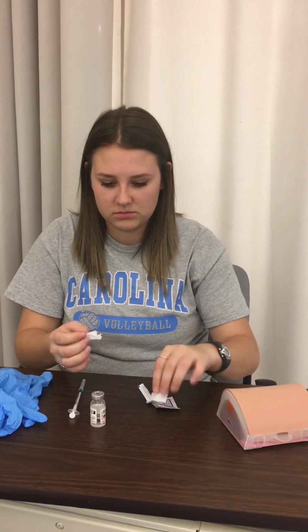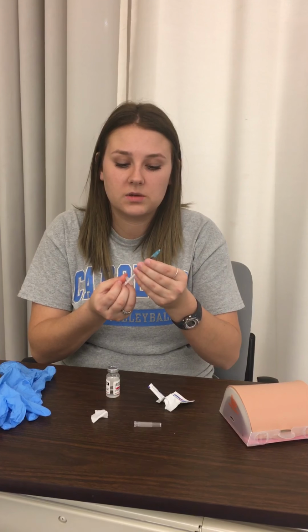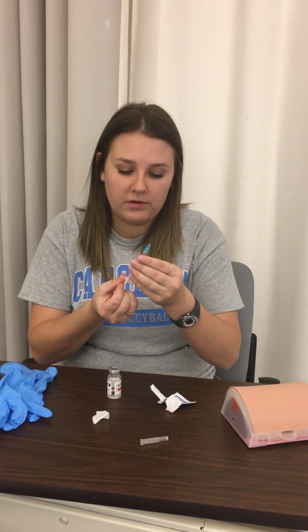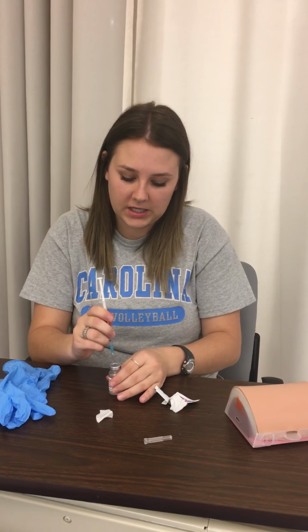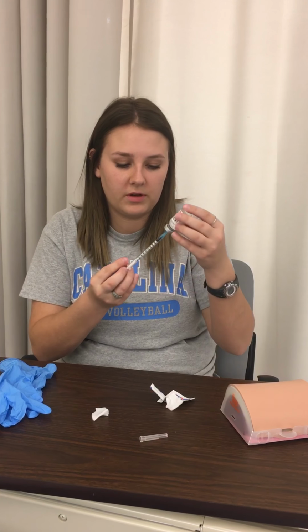So whenever you are preparing the medication, you're going to wash your hands. You're going to get an alcohol pad for the vial. You're going to want to clean the top of the vial, and then you're going to inject however much air as however much liquid you're going to take out. So we're going to give 0.5 mils. So then you're going to inject 0.5. You're going to withdraw 0.5 mils.